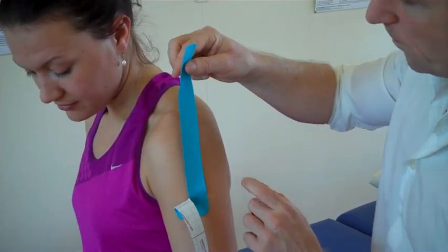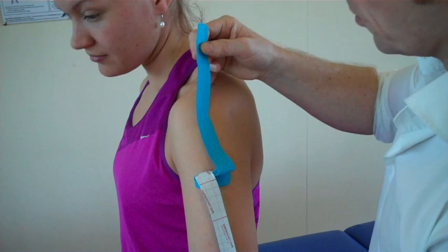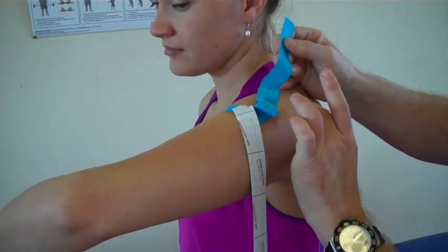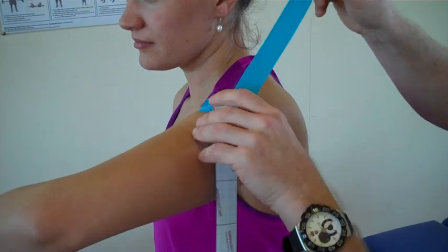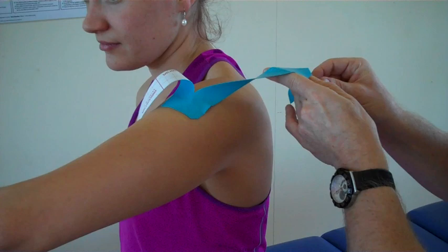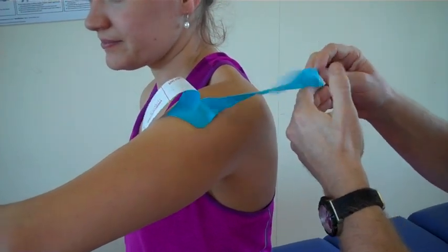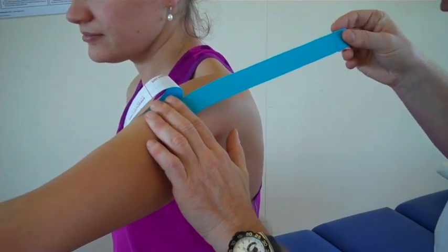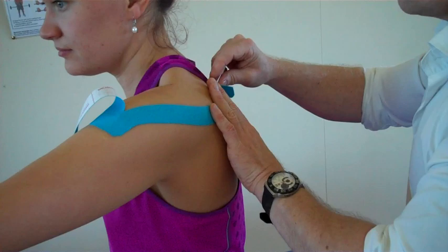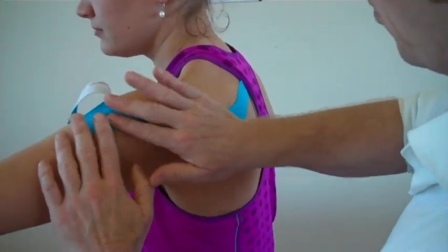What we're going to do first is use the shoulder and lengthen the posterior deltoid. So bring your arm forward and then slowly turn your arm in, so we've got some stretch onto the posterior aspect of the deltoid. Then this first leg is going to come around — with no stretch onto the tape, because the tissue is already on stretch. So we literally feed that around and curl it around with no stretch on the ends. That's working on the posterior aspect.